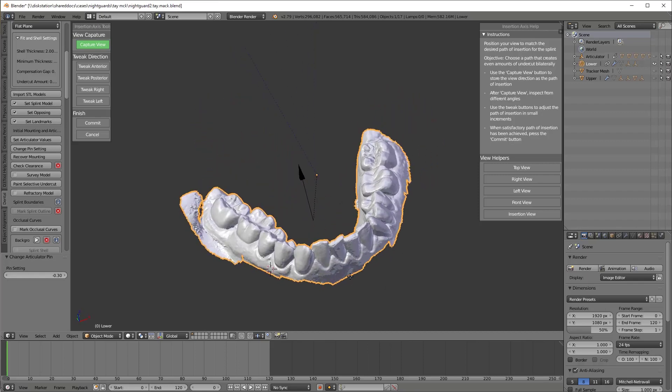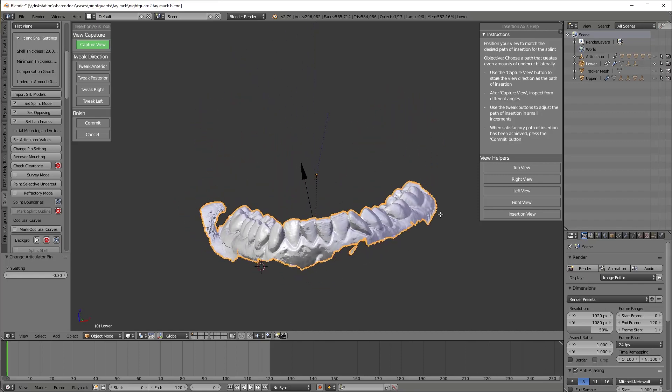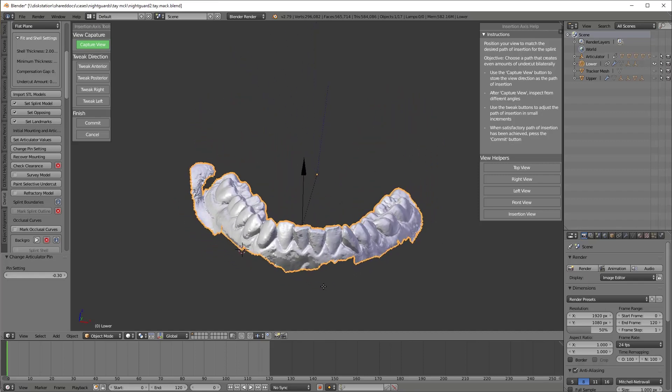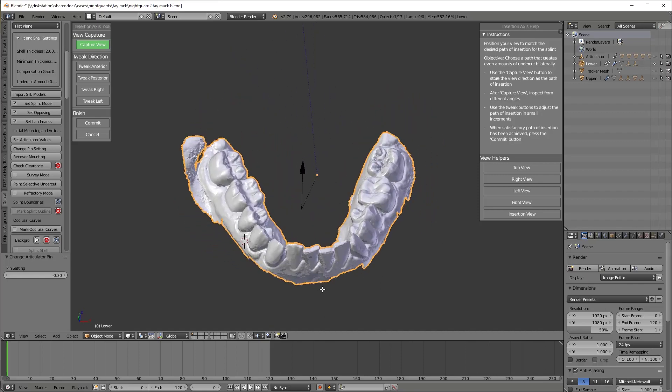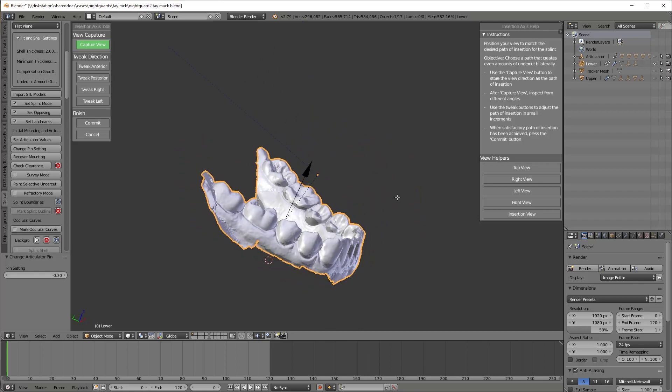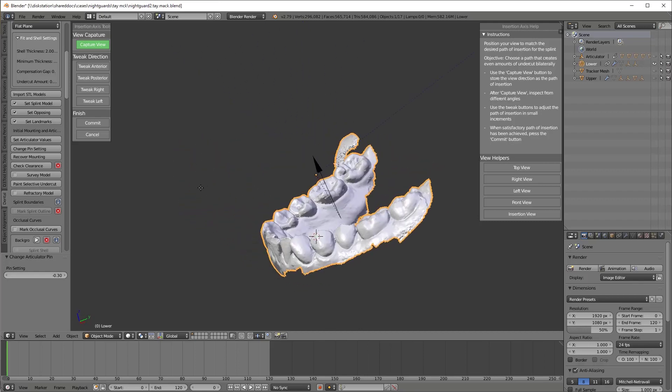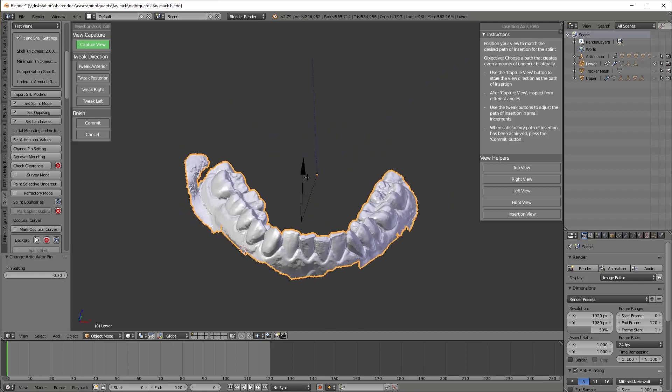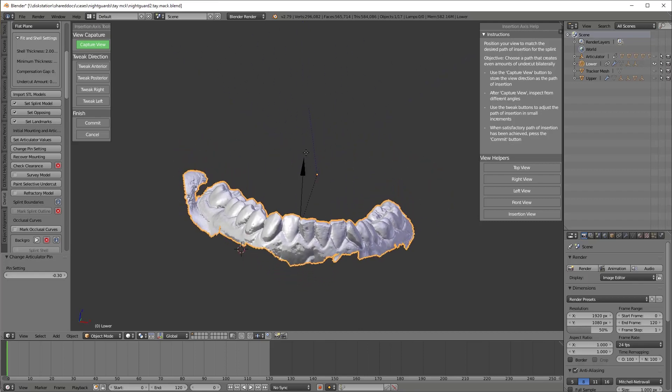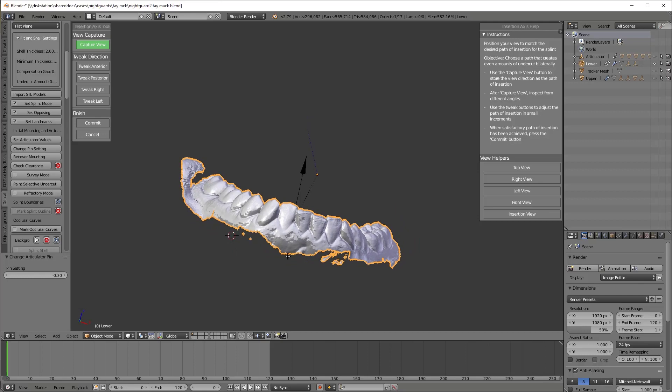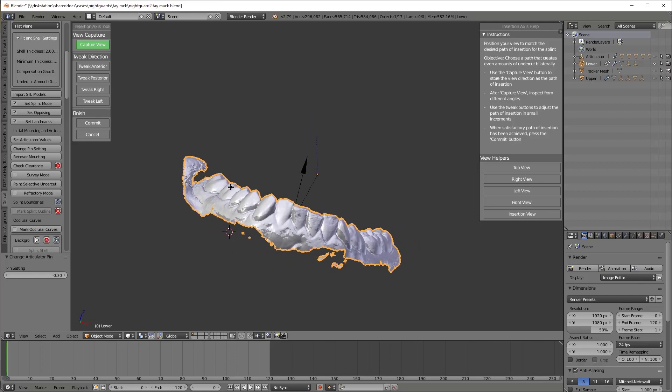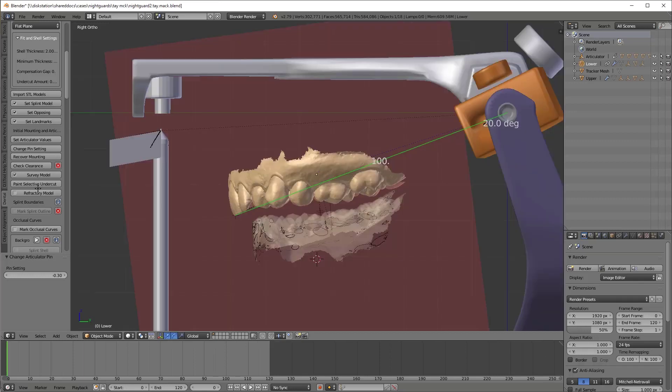I'm now doing the path of draw and determining whether or not I have a good one. Now typically I had capture view and then you'll see the black shaded areas where the undercut would be. I'm going to go ahead and hit tweak posterior a couple times. I almost always do. Just to get a little bit more undercut on the front teeth when I draw them.